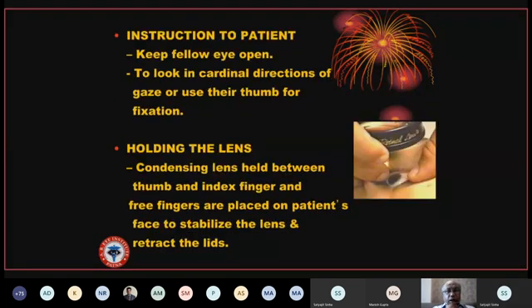I practice pure retina, and still I do get a lot of patients who are having their indirect ophthalmoscopy done for the first time. So they are not aware of what you are doing. While you're putting on the indirect ophthalmoscope, it's a good idea to tell the patient, light off, I'll be putting the light off, I'll be pushing the chair back, and I'll be examining your eyes with light. Because sometimes we don't tell them this, they're suddenly scared, light goes off, chair goes back, there's some metal piece in your hand, and especially younger patients are a little apprehensive, and elderly people are not very sure what's happening.